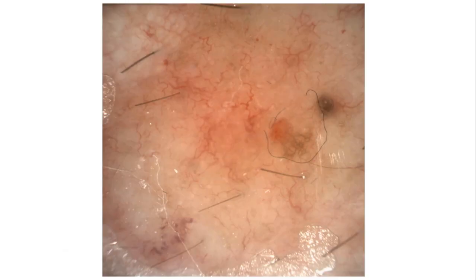So again, under dermoscopy, this is a very non-specific lesion. When you're layering your diagnostic tools, if you can't make a judgment call under one, you keep going. And so under dermoscopy, this is not very indicative of a basal cell carcinoma.